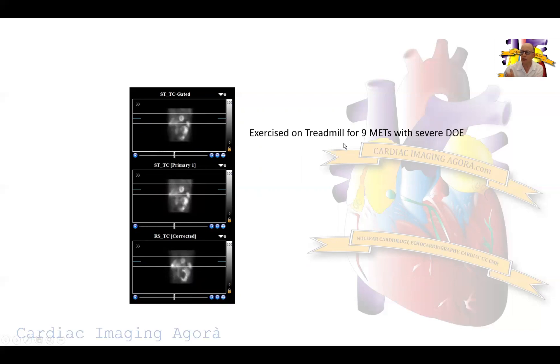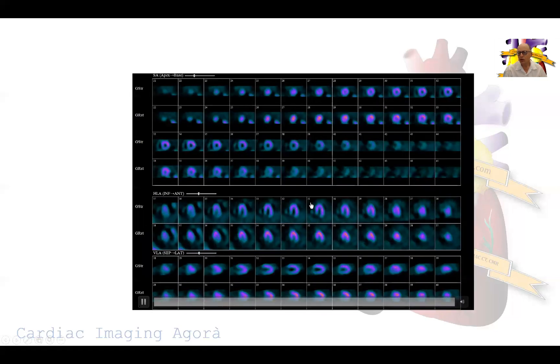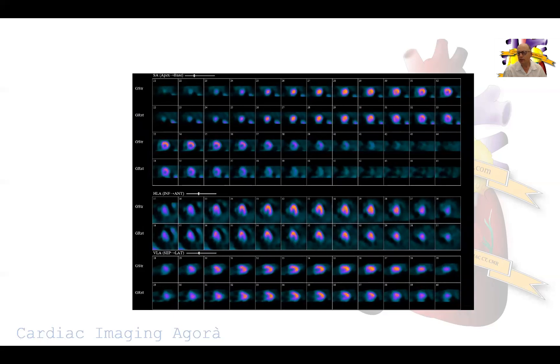The patient during the stress test went up to nine METs with severe shortness of breath. These are the perfusion images — this is SPECT, not PET. You have the rest images on the bottom and the stress images on top. You can see the heart at rest and stress, with some motion artifact — almost an 11 o'clock and 5 o'clock artifact on rest images not present on stress. In general, the perfusion images look quite okay. On the gated images, you can see normal motion and normal function of the left ventricle; even the right ventricle appears normal.